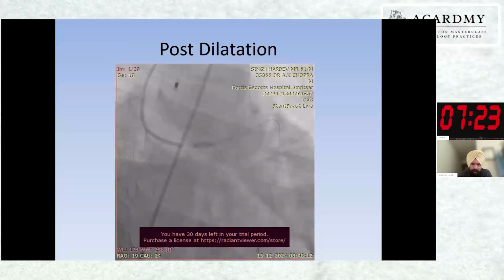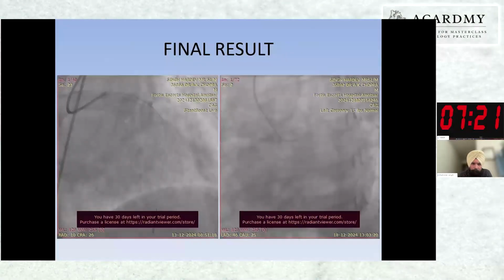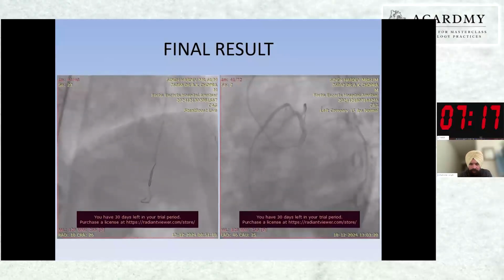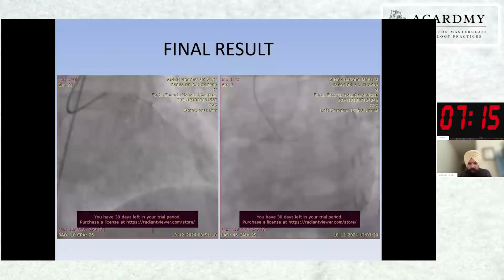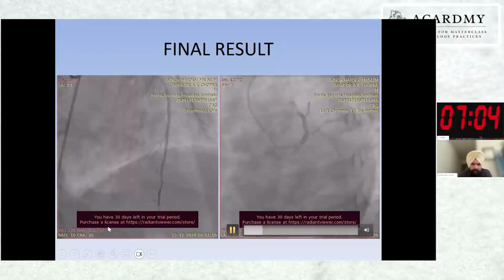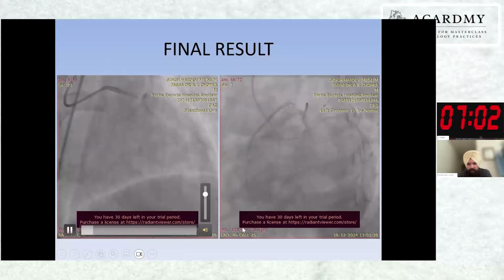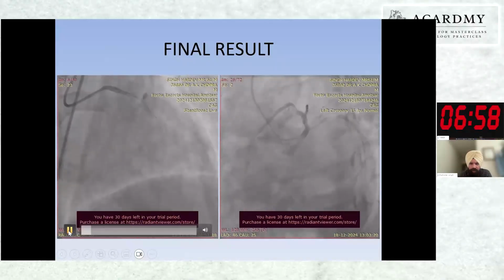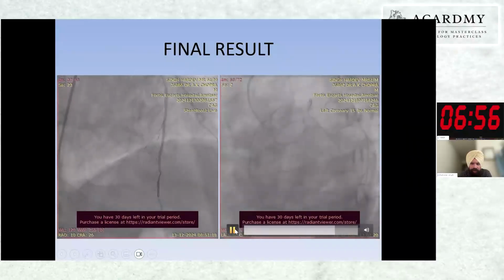We have taken only a few shots because the patient was very sick. He was having saturation of 85, 86% on IABP, and augmented BP was around 90 by 60. So this was good flow in LAD. Ostial disease in LCx was present, but we left it as such. Then the patient was shifted to ICU.